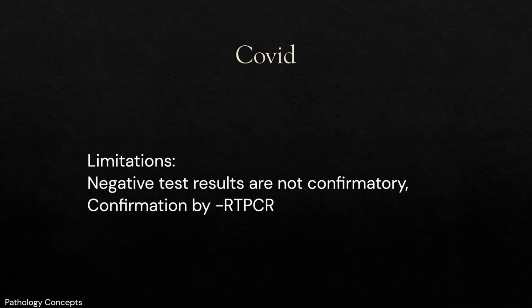A negative result may occur if concentration of antigen in the specimen is below the detection limit of the test, or if the specimen was collected and transported improperly. Therefore, a negative test result does not eliminate the possibility of SARS-CoV-2 infection, and it should be confirmed by RT-PCR.